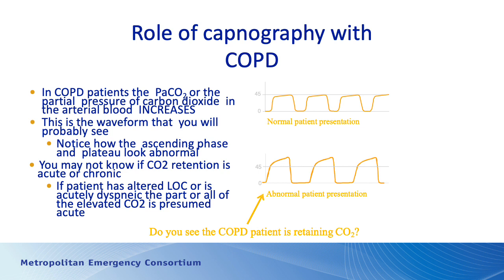So we can look at these waveforms. The top waveform looks normal. The bottom waveform has a bit of a shark fin appearance, suggesting spasm, but you also see that the CO2 level is higher than we would consider to be normal.